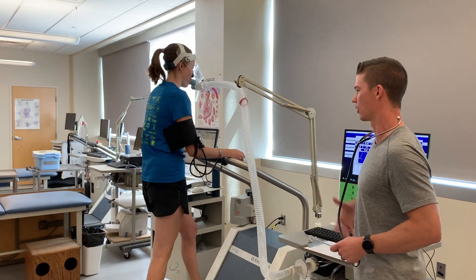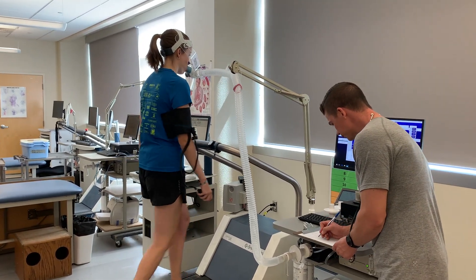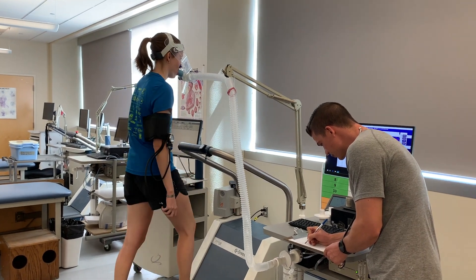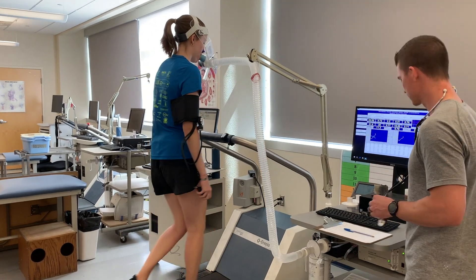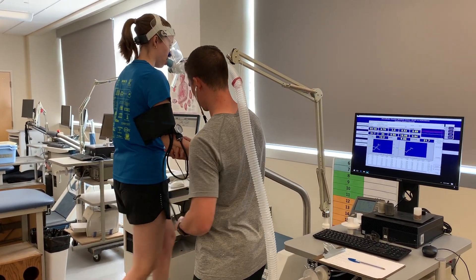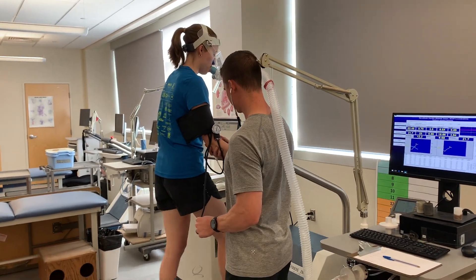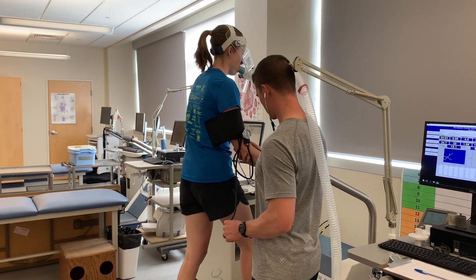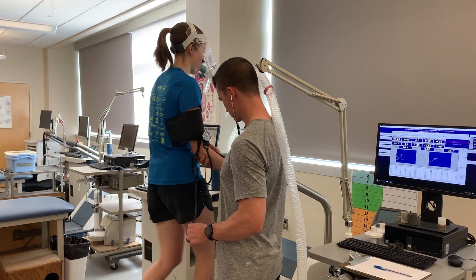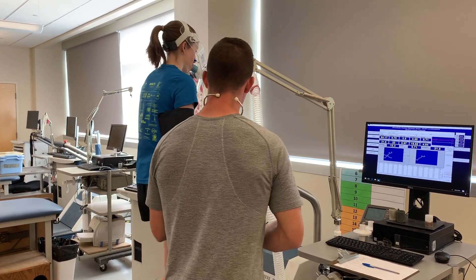We want our subjects to have their arms down by their sides like they're walking normally. Let's make sure you've got your arms down while we take blood pressure. Okay, good job.